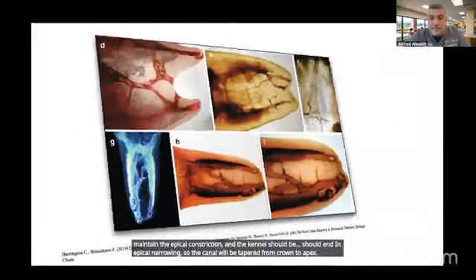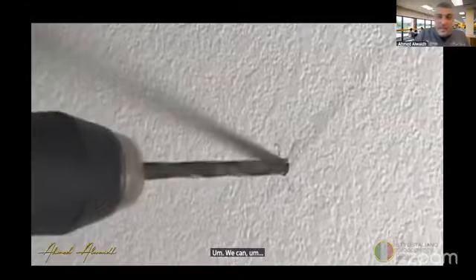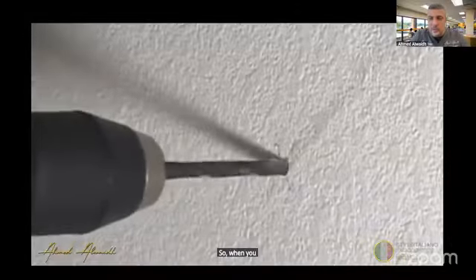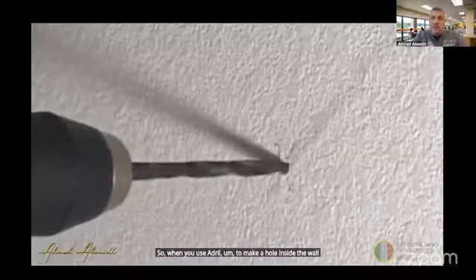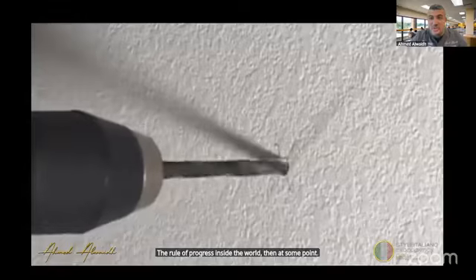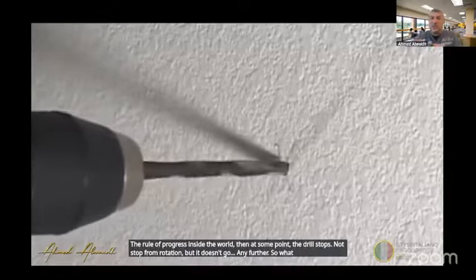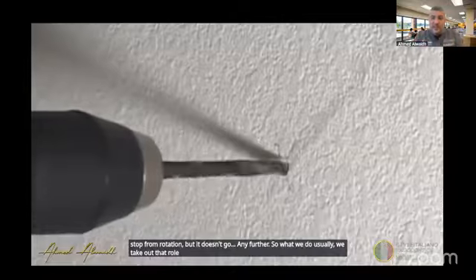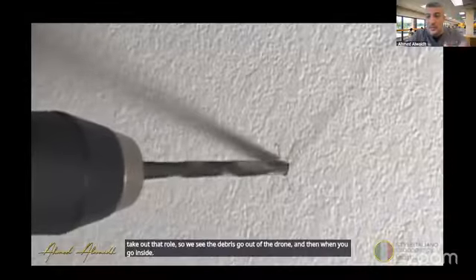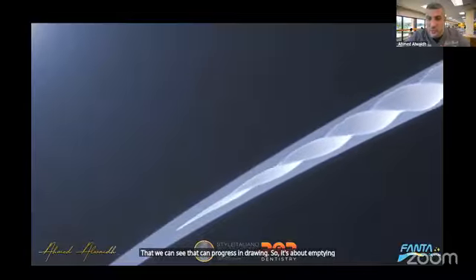We can describe root canal instrumentation just like using a drill. When you use a drill to make a hole inside a wall, the drill will progress inside the wall. Then at some point, the drill stops, not stops from rotation, but it doesn't go any further. So what we usually do, we take out the drill. We see the debris go out with the drill. And then when we go inside again, we can see the drill can progress in drilling. So it's about emptying the flutes from the debris.